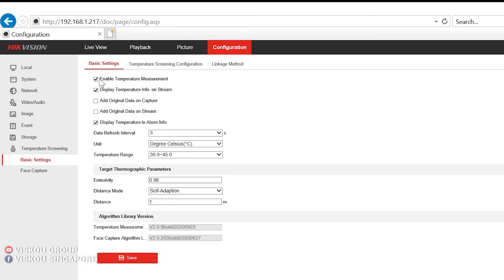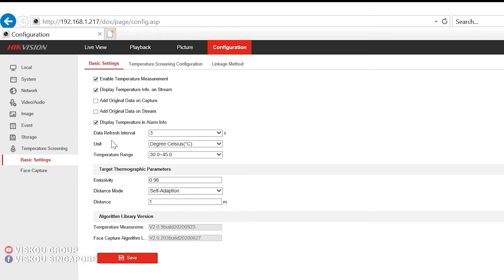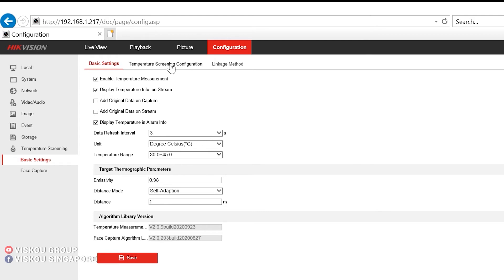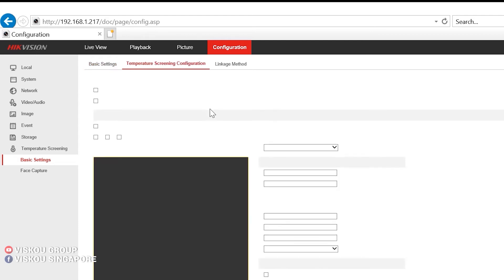First you need to enable the temperature measurement, which is here. You can also display the temperature info on a live stream and display temperature in alarm info. You can set the data refresh interval, the unit for the temperature, and the temperature range. So others will be set as default. We can go on to the temperature screening configurations.